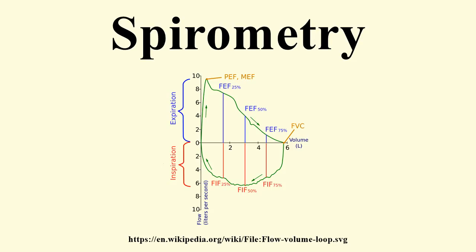Forced inspiratory flow 25 to 75% or 25 to 50%. Forced inspiratory flow 25 to 75% or 25 to 50% is similar to FEF 25 to 75% or 25 to 50% except the measurement is taken during inspiration.